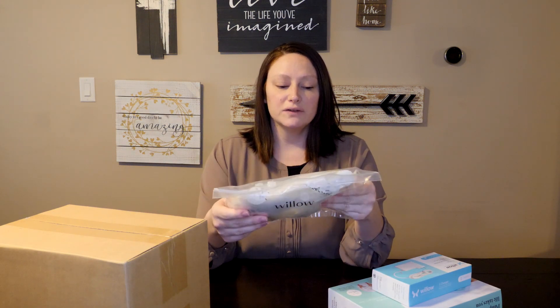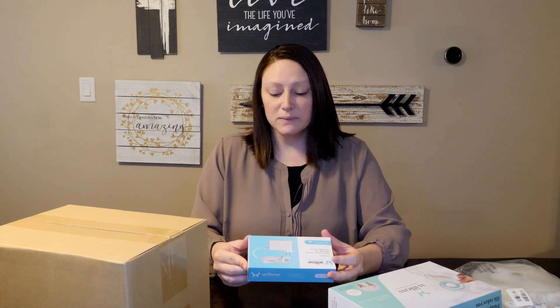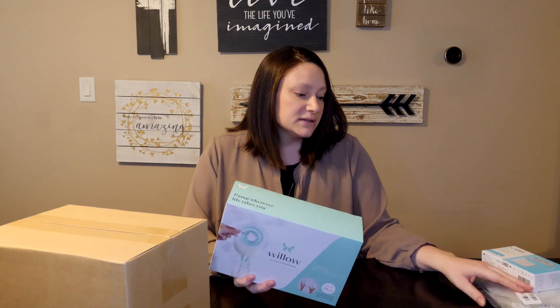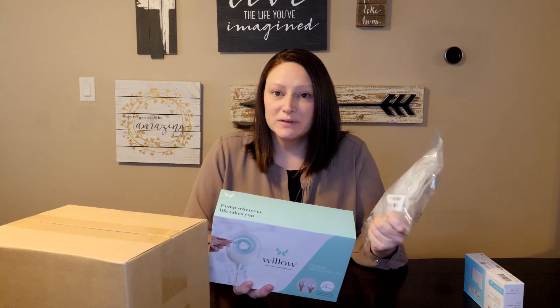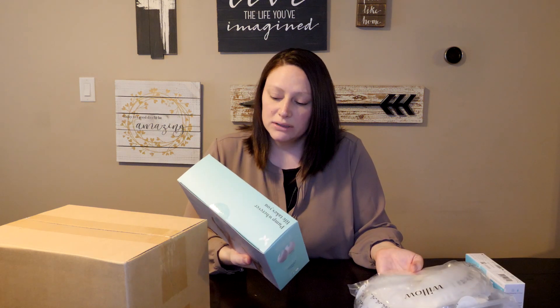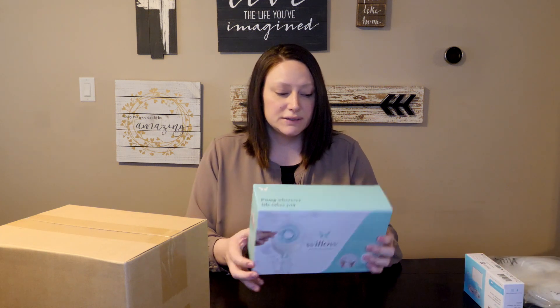I ordered the pump — that's what's in this box. I also ordered a full set of bags, so 48 bags, and then an additional charger because I read online that it only comes with one charger and you can only charge one of the pumps at a time — it's two separate pumps for each breast. I bought an extra charger so that'll be helpful. I also saw that they have these new milk containers, because my concern with the bags is that they cost upwards of 50 cents a bag. If you're pumping a couple of times a day and you use two bags at a time, that can really add up. So I thought it would be more economical to get the milk containers, but I also got bags just in case.